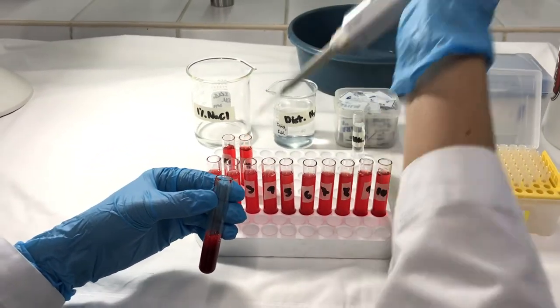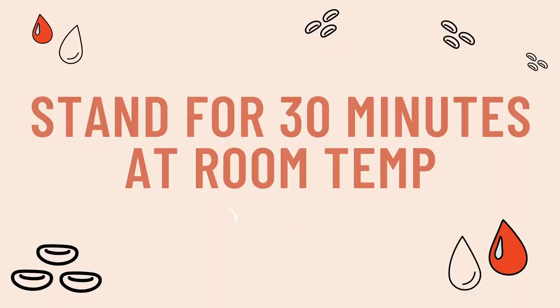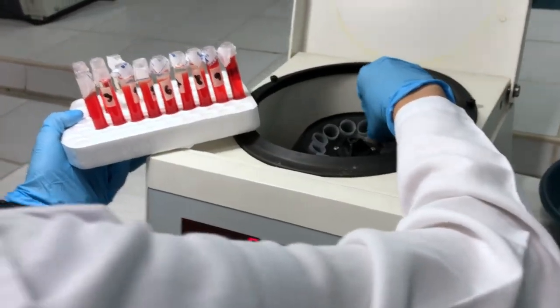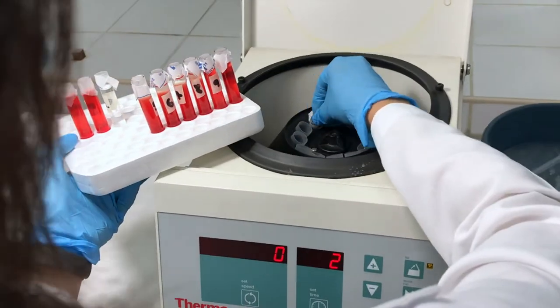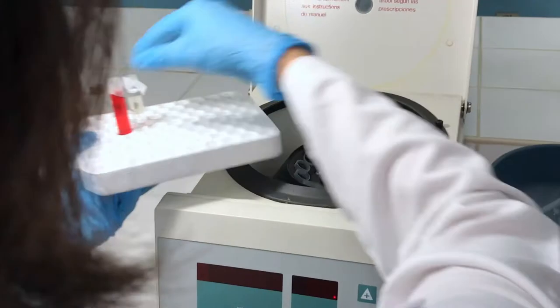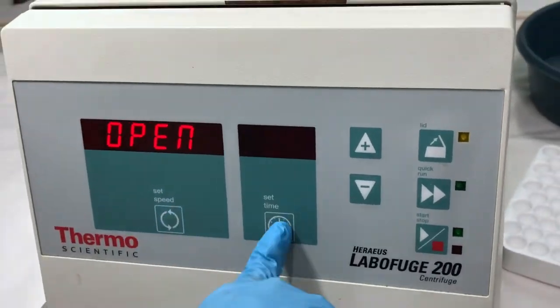Once you have dispensed blood into all the tubes, allow them to stand for 30 minutes at room temperature. Then, place all your tubes into a centrifuge. Make sure that the tubes in the centrifuge are balanced. Centrifuge the tubes at 2000 rpm for at least 2 minutes.